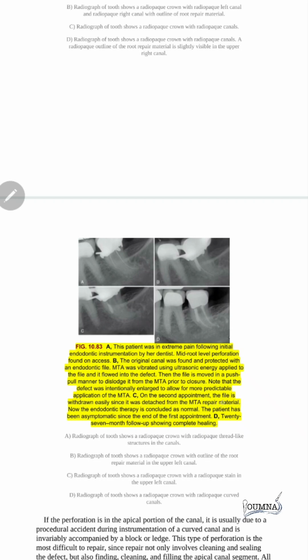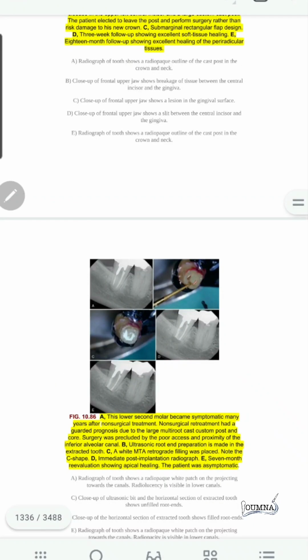On the second appointment, the file is withdrawn easily since it was detached from the MTA repair material. Now the endodontic therapy is concluded as normal. The patient has been asymptomatic since the end of the first appointment, with a 27-month follow-up showing complete healing.